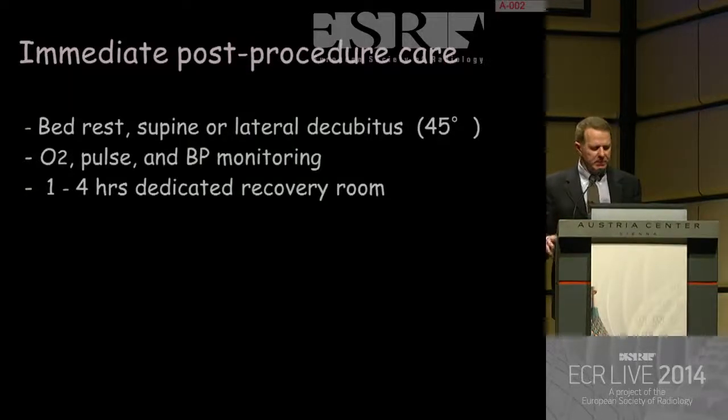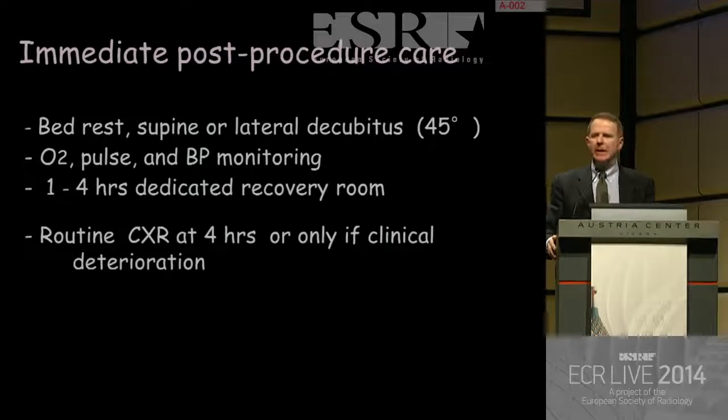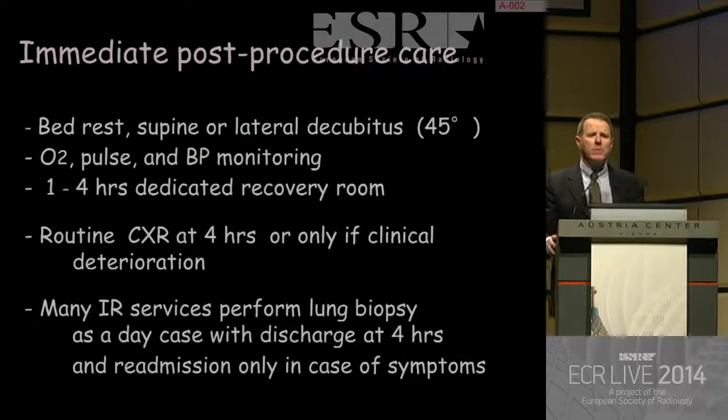Post-procedure care, simple: bed rest, supine or lateral decubitus according to entrance site. You check O2, pulse, blood pressure monitoring, and according to the different praxis, you keep the patient 1 to 4 hours near you in a dedicated recovery area, if you are rich enough to have a dedicated recovery area. A routine chest X-ray can be performed at 4 hours. Other groups do a chest X-ray only if clinical deterioration is appreciated. Now, many services perform lung biopsy as a day case with discharge at 4 hours and readmission only in case of symptoms.